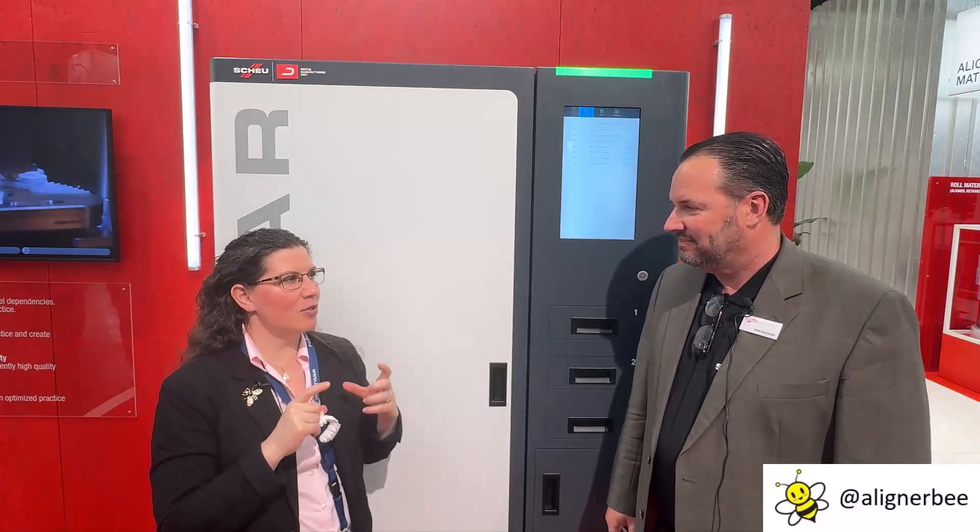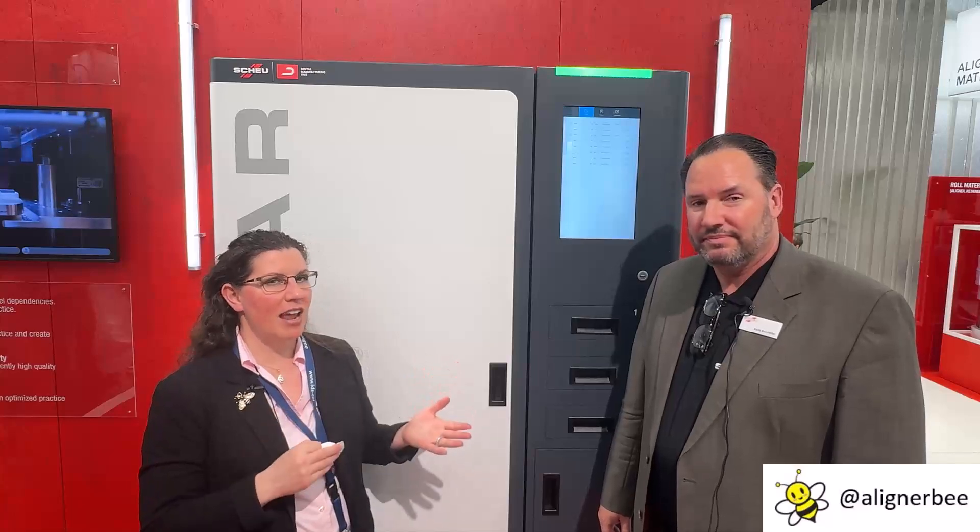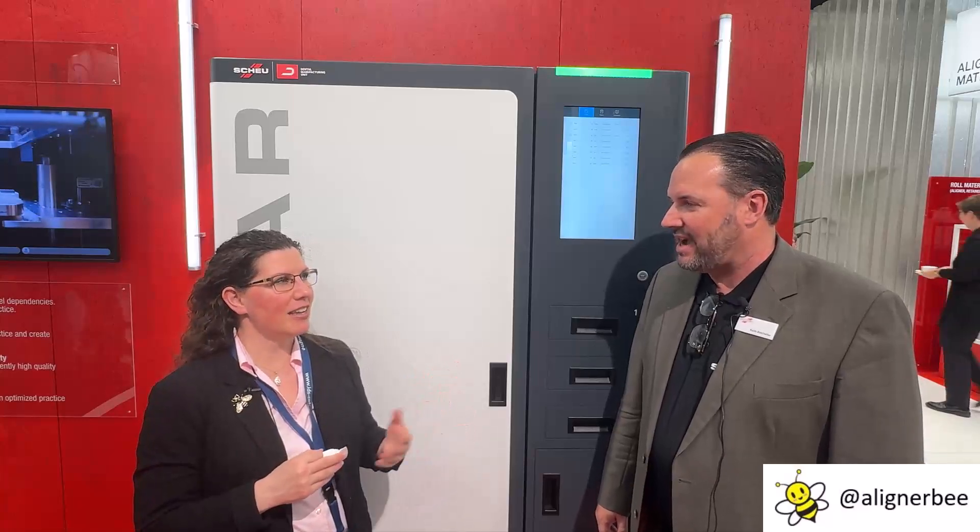And this can hold the 125-millimeter discs? Correct — 125-millimeter discs. It can be a Shoei foil, Bay Materials, Zendura, any material that you want to use. It's an open system for materials, and it's an open system for software as long as you have an STL file for printing. Correct.